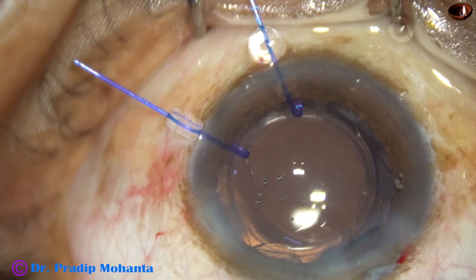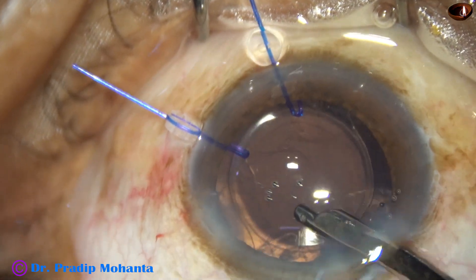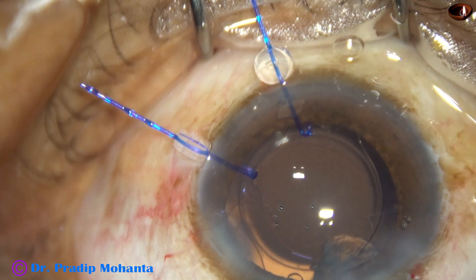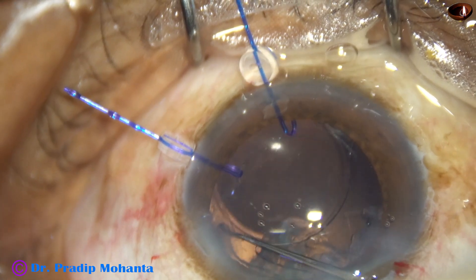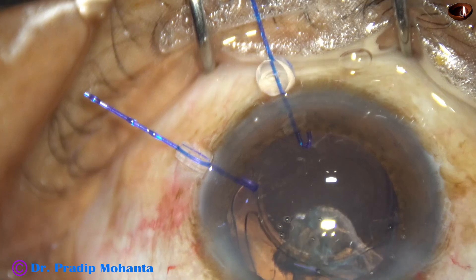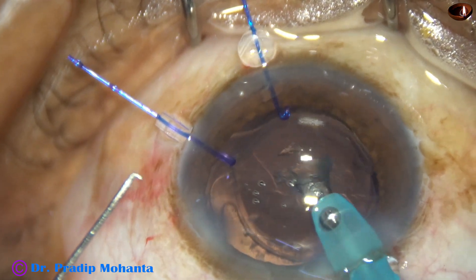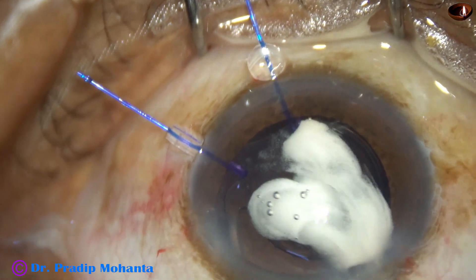There is some cortex remaining. I remove it with the Simcoe cannula and could remove most of it. However, there is a chunk of epinucleus just under the main incision. To get that chunk, I rotate the lens so that the haptic is away from it, and the chunk of epinucleus is easily removed. At this time, I see some vitreous coming to the port, so I immediately use reflux, come out, and inject some triamcinolone acetonide.